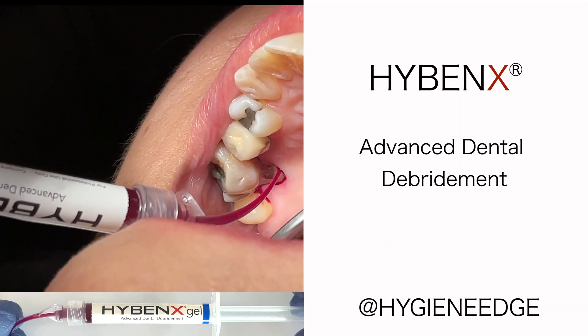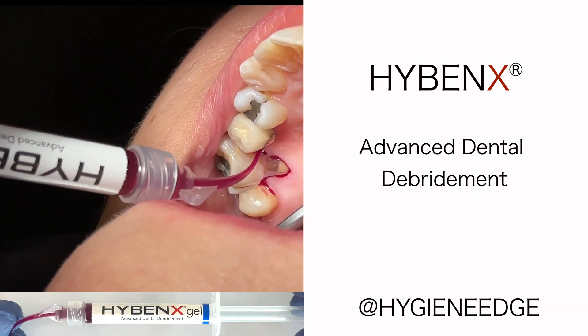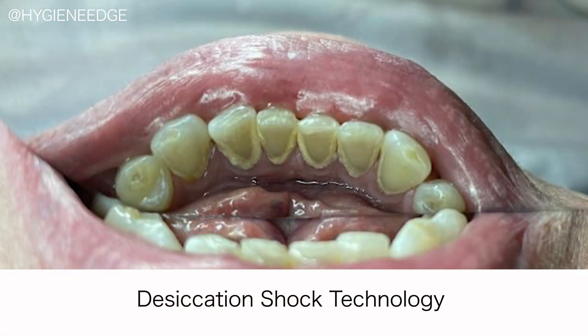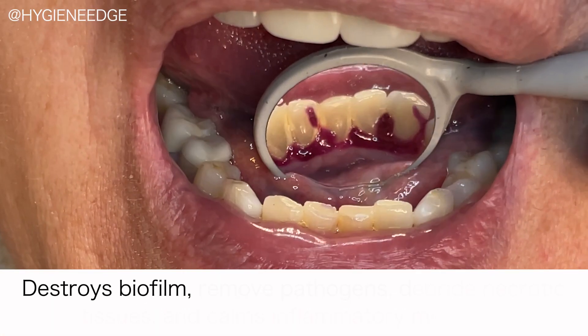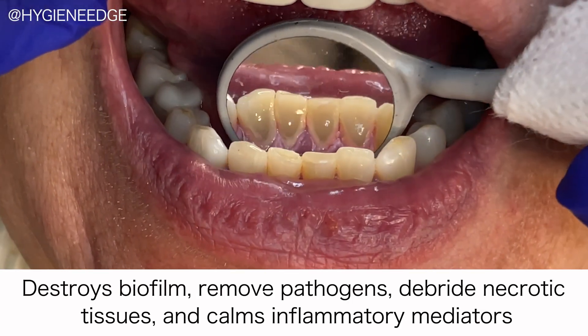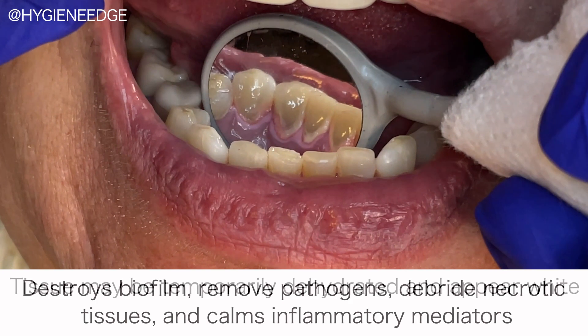This is Hybenex. It's an FDA-cleared, antibiotic-free cleaner that dehydrates the microbial environment by using a process called desiccation shock technology to destroy the biofilm, remove pathogens, debride necrotic tissues, and calm inflammatory mediators — all without harming healthy tissues.